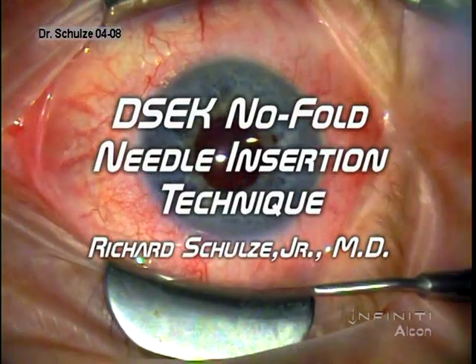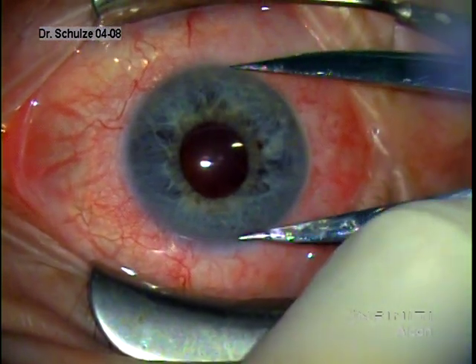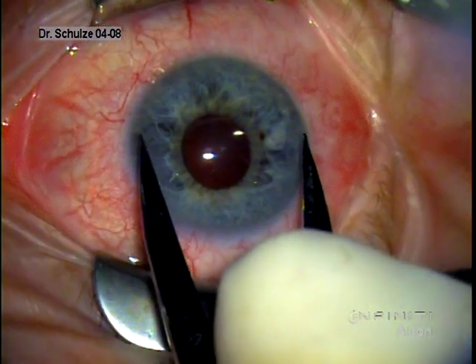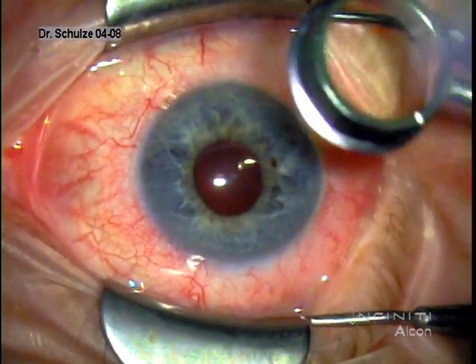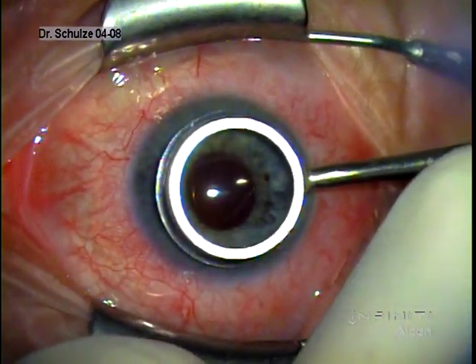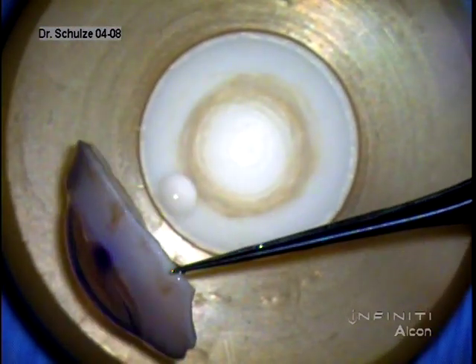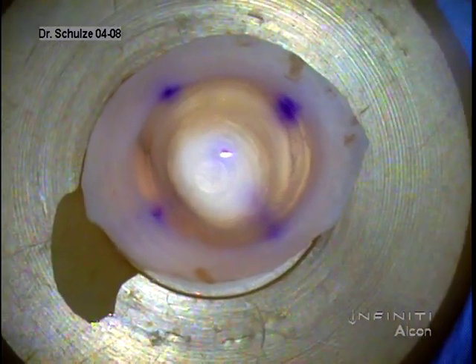This is Dr. Richard Schultz Jr., demonstrating a DSEC case with a needle insertion technique over a sheet's glide without folding the donor. You can see us at the beginning measuring the diameter of the cornea. If the cornea is over 11 millimeters in diameter, I prefer to use a 9-millimeter donor. Less than that, we use an 8.5 or 8-millimeter donor. We then mark the host cornea with the appropriate size marker to help guide our resection of Descemet's membrane.